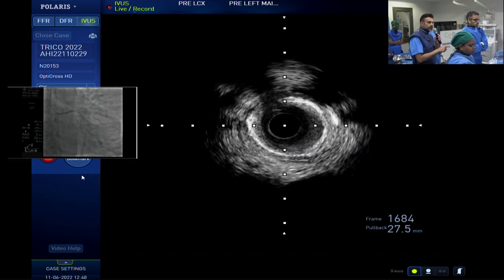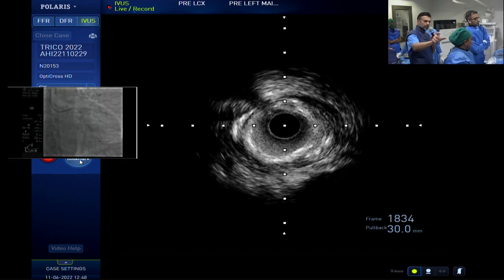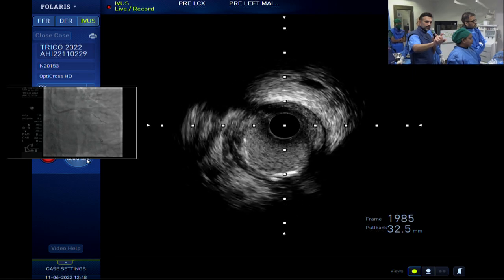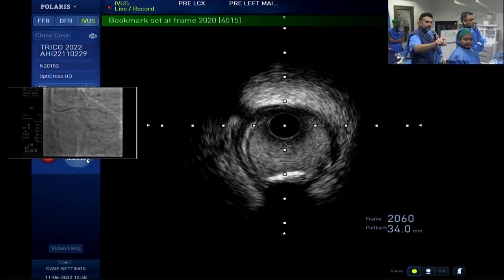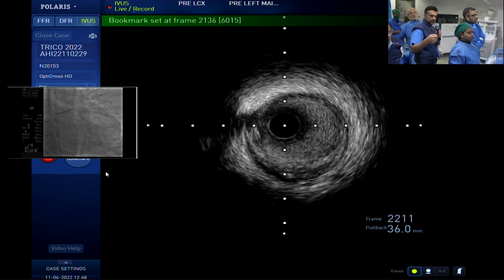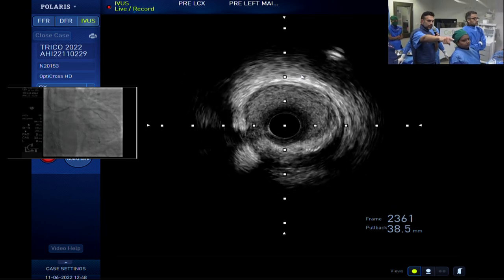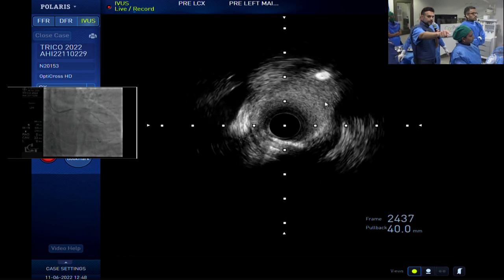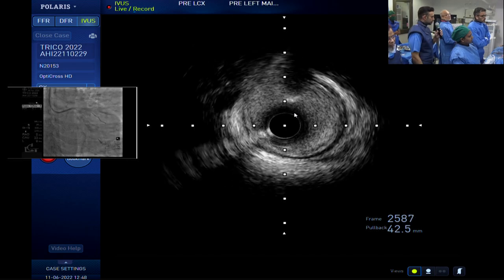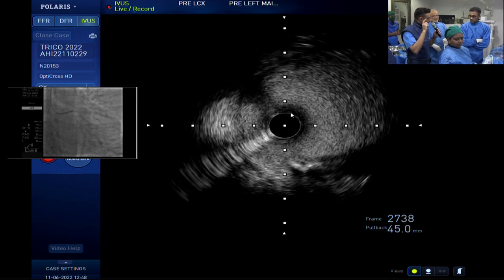Okay, fluoro here, now cine. Okay, so there's still a little bit of disease there. So we're going to wait just a second. And cine here. Cine, there. So that's your landing zone. Okay, because there was less than 30% plaque there. Okay? And you'll see your other wire come in just a minute. And cine here now. Wire is cine. So that's the point at which you tell yourself, do not go past this point with my stent for any reason, because I'm going to end up landing halfway across the ostium. So that's your safety marker.